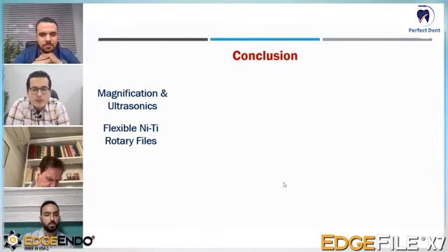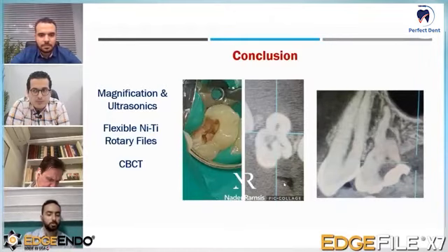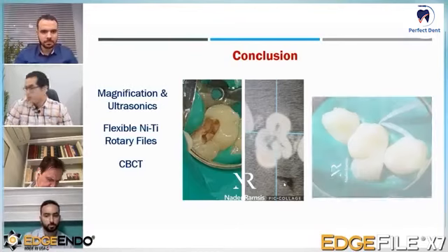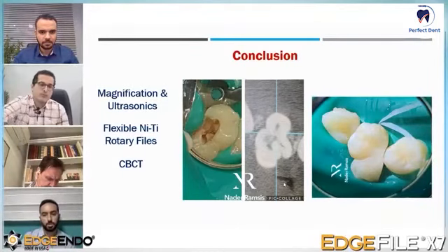And finally, especially in difficult cases or anatomical variations, having a preoperative cone beam CT will allow you to go directly through the pulp chamber at the locations you can see without destroying too much tooth structure in difficult anatomical variation cases. So that's it.